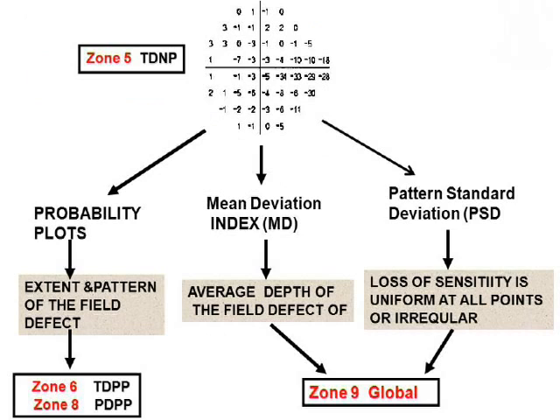See, this total deviation numerical plot will now become the base for the probability plots, the base for the mean deviation index, and the base for the pattern deviation and pattern standard deviation. The probability plots: these numbers are converted into the probability plots according to the p-value.